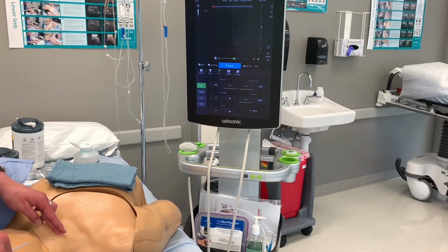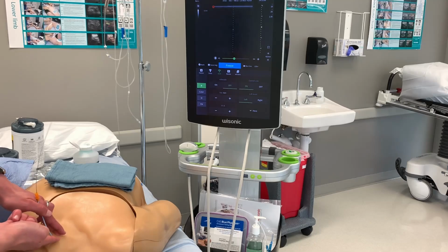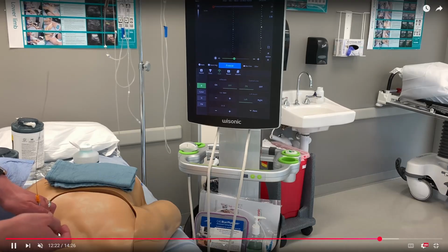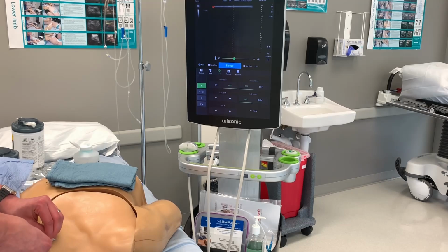And again, you'll see me having to let go of things and pushing at awkward angles. Please keep in mind, this is a fake patient and it's rubberized, so I'm meeting a lot of resistance. And what you saw with my finger right there was a portion in time in which you could use a scalpel to slightly nick the skin and underlying tissue to allow the dilator to insert freer. Right there. Threading it in. Textbook says you will feel distinctive pops upon insertion as you're going through the tissue layers.